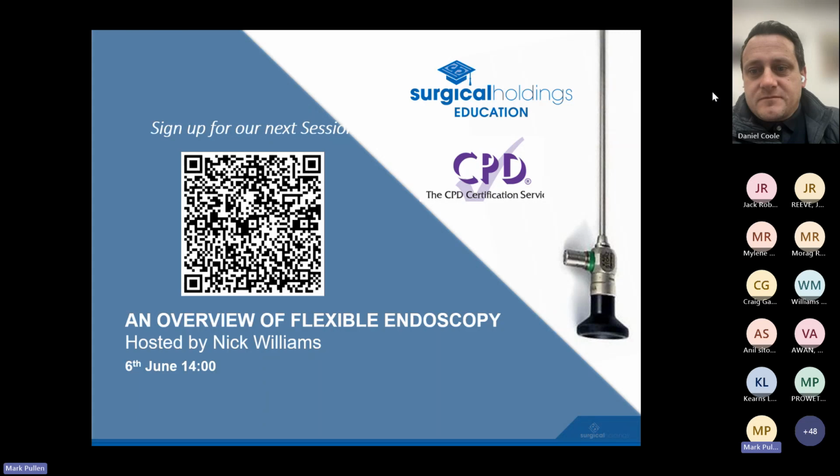Yeah, I mean, from what I know, it's unfortunately a flawed design, isn't it? A scope, it's not sort of designed for longevity. So at some point, it's gonna break, it's gonna leak. It's just down to how it's handled, how it's sterilised, how it's looked after, really. But I couldn't put a sort of time scale on it with moisture ingress. I'd have Jack. You got anything else?